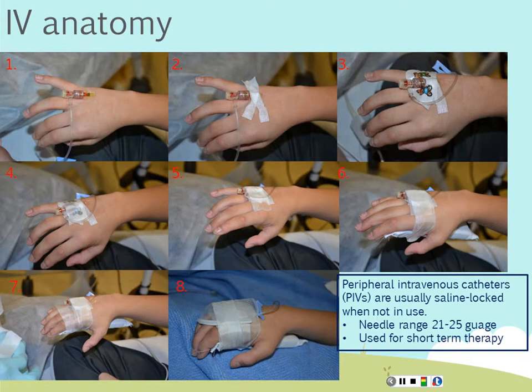Most facilities now have gone to saline locking versus heparin locking, so they will flush these with saline when they're done and just clamp off the end. So they would be what's called saline locked when not in use.